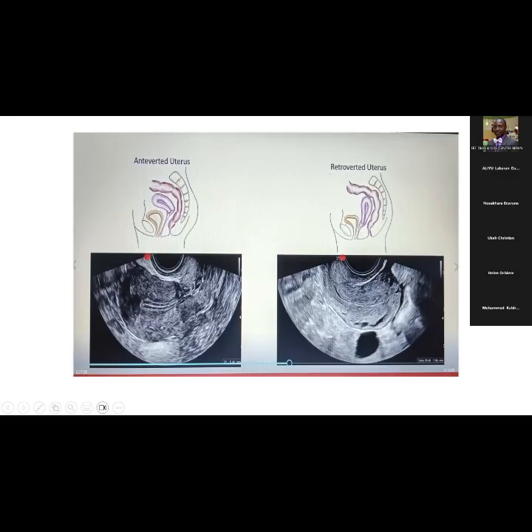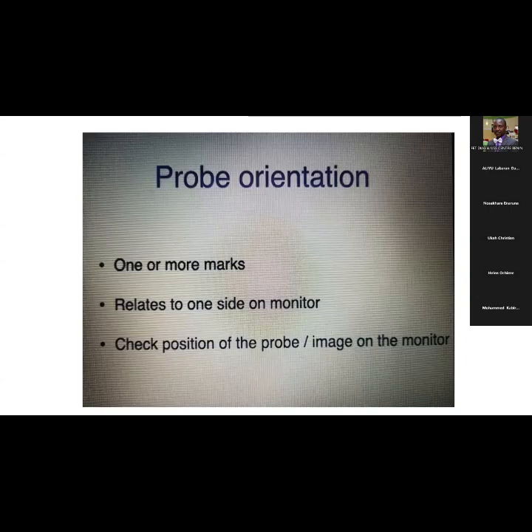So the one or more marks on the probe, just a summary of what I've said, help you to get the orientation and how to relate to one side or the other of the monitor. Always check the position of the probe before you start your scan.